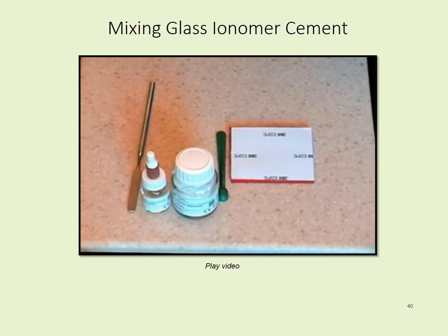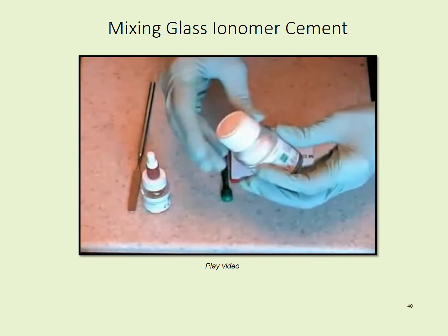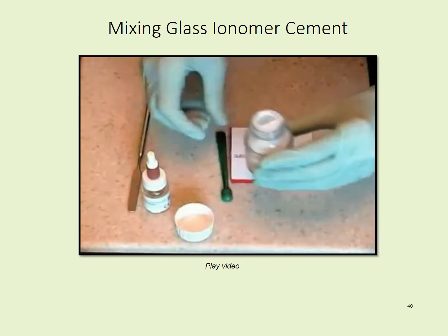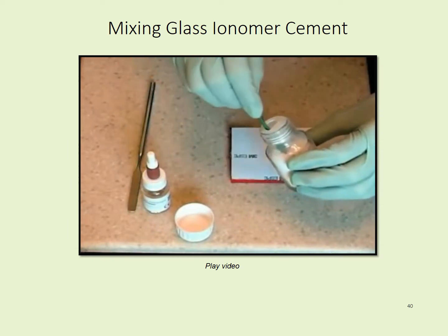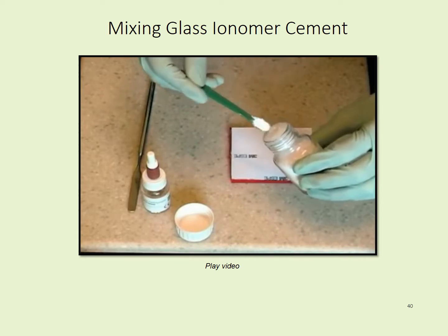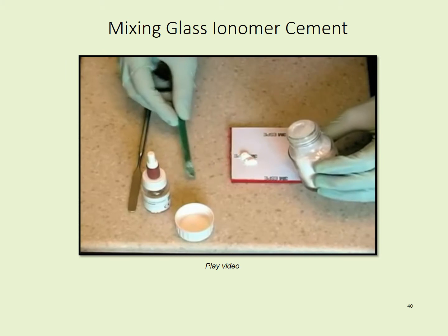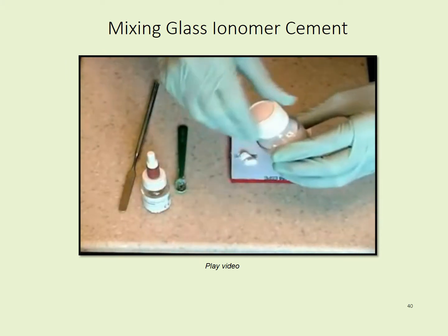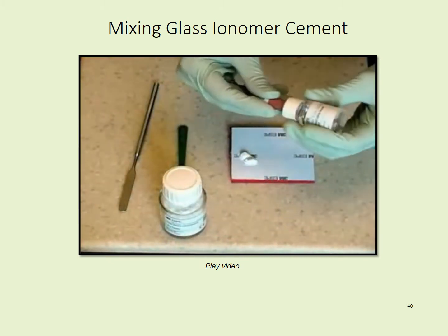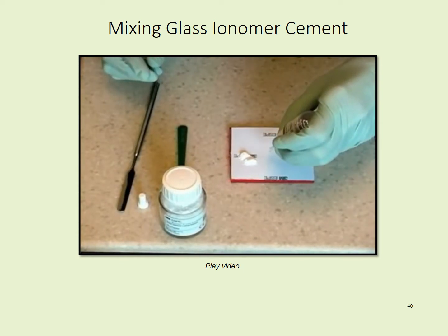Mixing glass ionomer cement for permanent luting. Read the manufacturer's directions and fluff the powder in the closed bottle. Fill the measuring scoop without packing and level against the plastic lip in the neck of the bottle or with the cement spatula to remove excess. The amount of powder needed is determined by the amount of cement needed for the procedure and by the manufacturer recommendations. Place the powder on the right side of the pad. Replace the cap on the powder bottle.